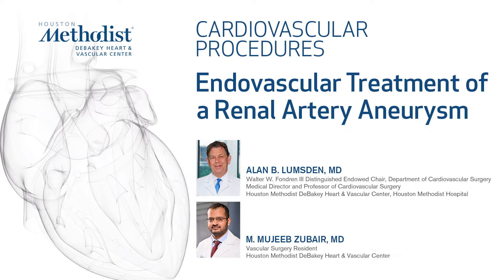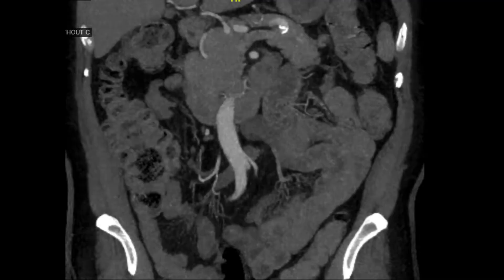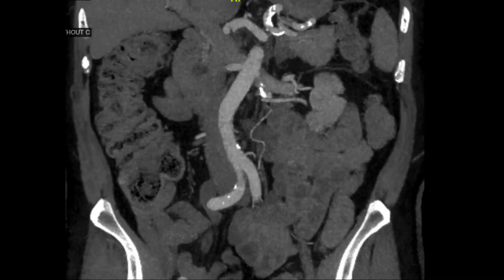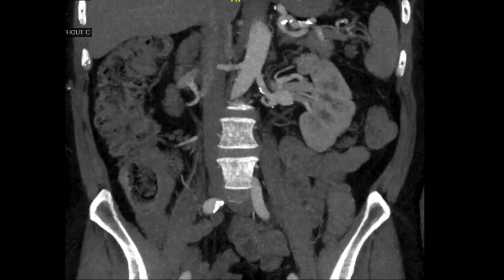This video demonstrates repair of a 3 cm mid renal artery aneurysm in a 70-year-old gentleman who presented with abdominal pain. CTA performed revealed a 3 cm aneurysm, bilobed in structure, arising from the mid renal artery.